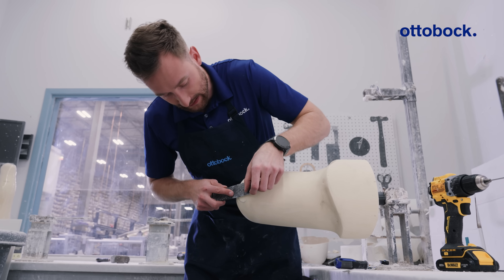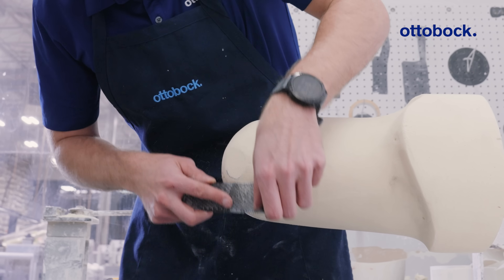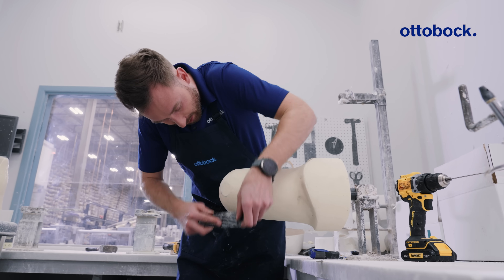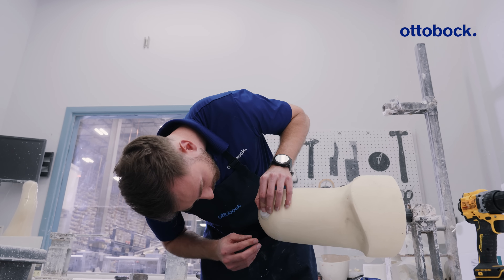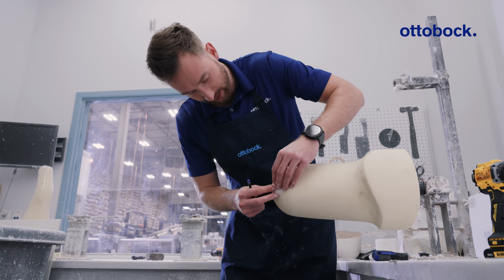It's crucial that you take your time during this step to ensure you do not have a leak in the finished test socket that we're going to be fabricating. Just short, easy strokes — that is looking great. The next step is we're going to go ahead and retrace it so we know exactly where it is.